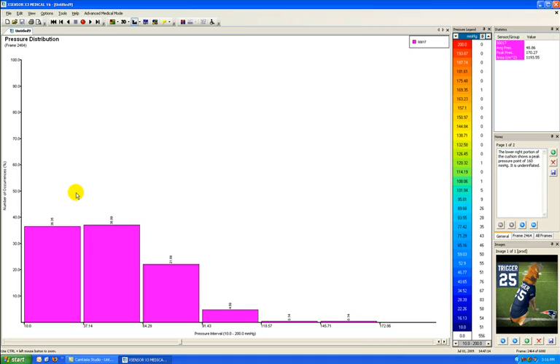So if you're looking for pressure redistribution or looking to establish the lowest pressures on the body, we would see most of the values fall within the first 2 or 3 columns. If we're beginning to see values falling on the outer part of the graph, that would express that there are high pressures that are of definite concern to us, and therefore we would complete an adjustment to the seat or to the design of the seat that would seek to minimize those pressures.